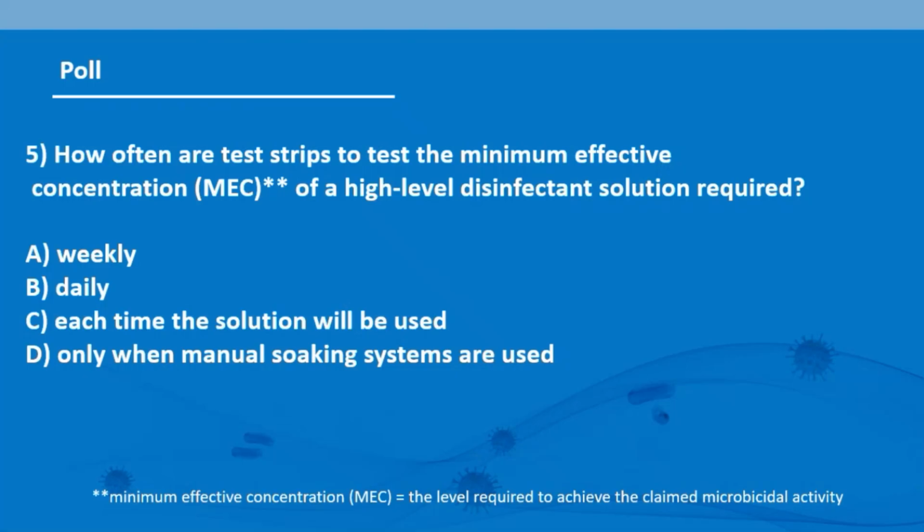Okay, another poll question. How often are test strips to test the minimum effective concentration, MEC, of a high-level disinfectant solution required? Weekly, daily, each time the solution will be used, or only when manual soaking systems are used? And the correct answer is C, and we'll talk about that a little more.